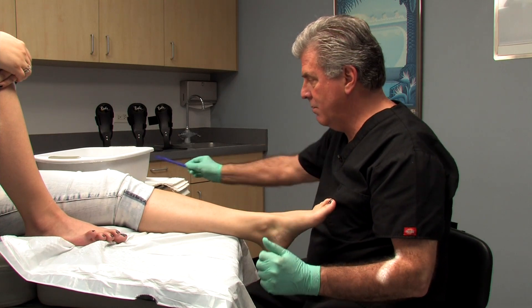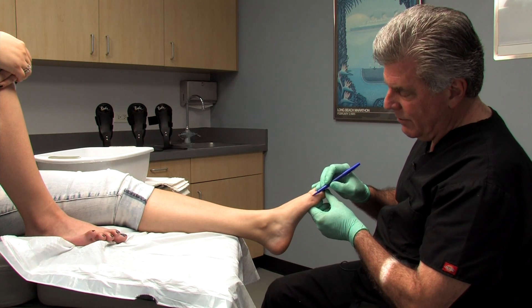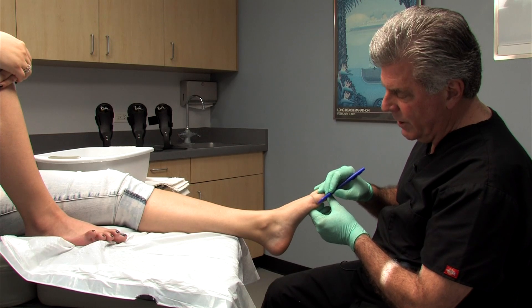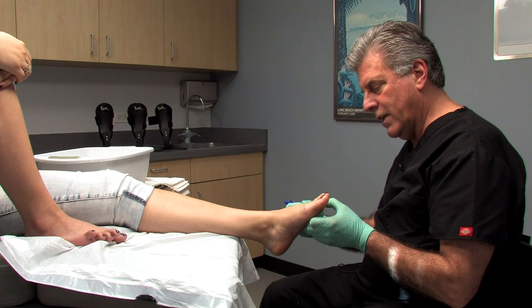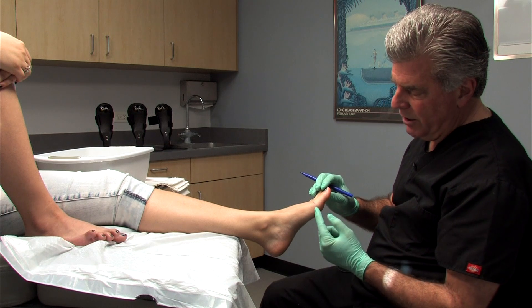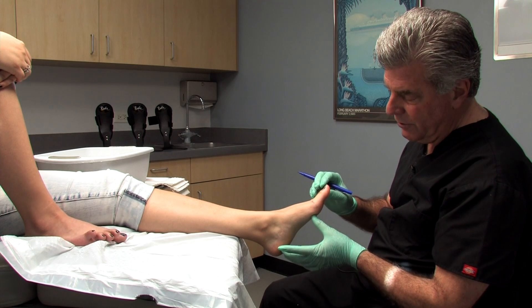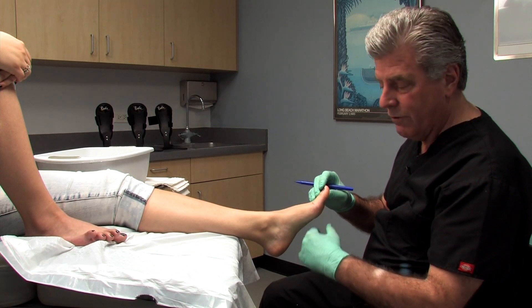Once everything is set up, we're going to draw two key landmarks: a bisection of the first metatarsophalangeal joint and a bisection of the fifth metatarsophalangeal joint using just a Sharpie pen. This tells the lab where to set the balance platforms so the length of the orthosis is accurately placed in an optimal position to control the forefoot.